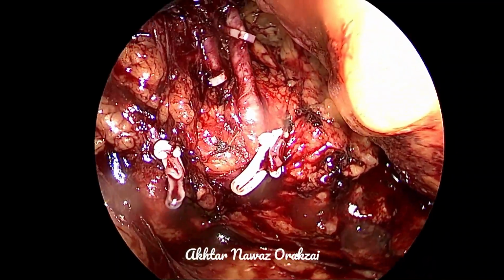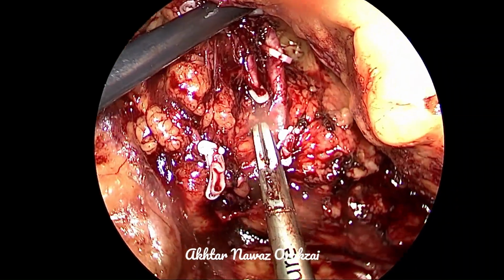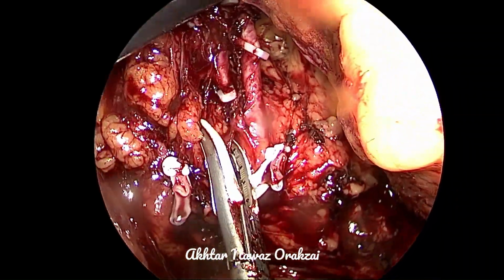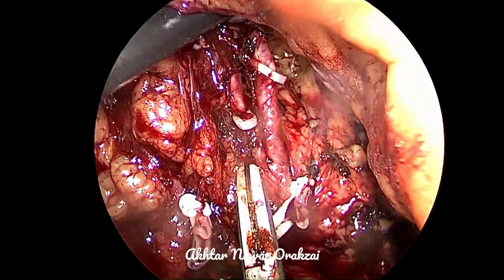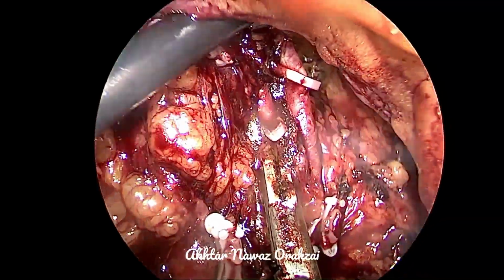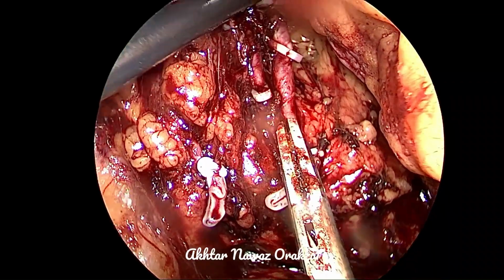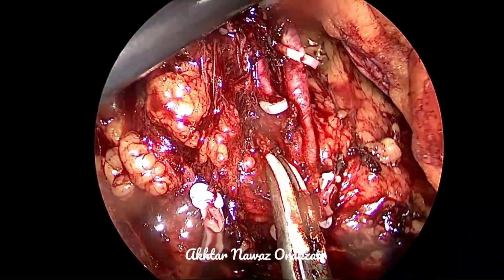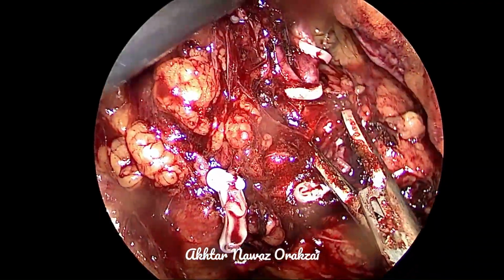There is a single renal artery arising from the aorta, which is then bifurcating into two branches. So we clipped the two branches separately. Now we have decided, as the vein is out of our sight, we can easily dissect the para-aortic lymphatic tissue and dissect out the main stump, which can then easily be clipped.